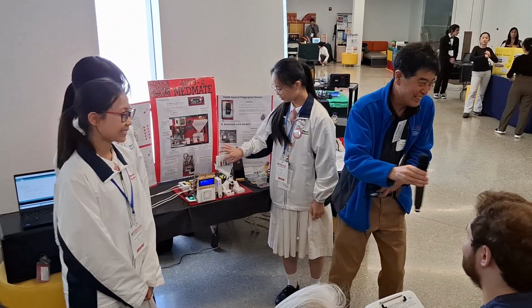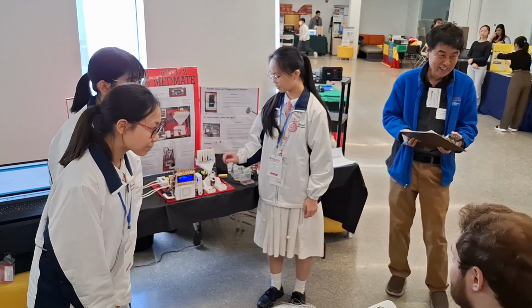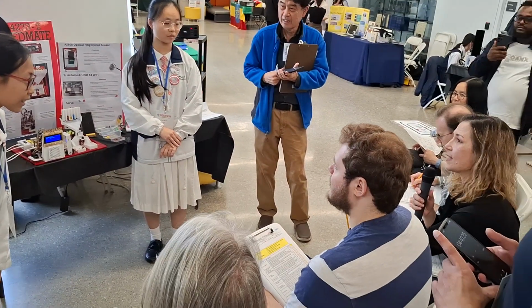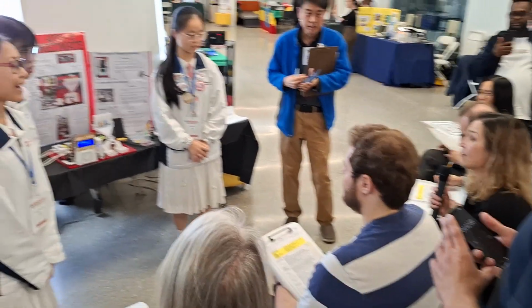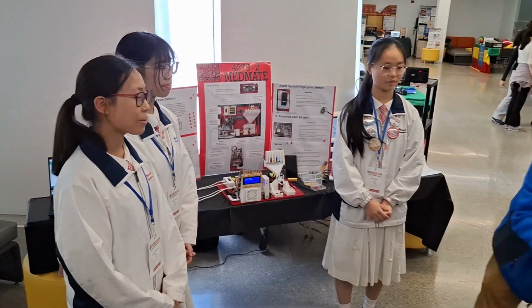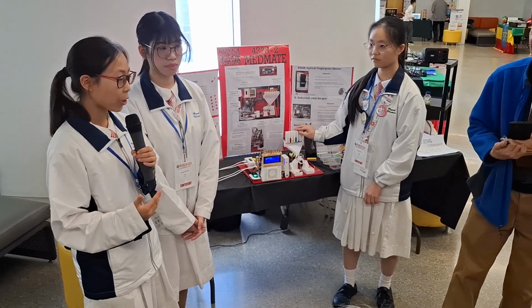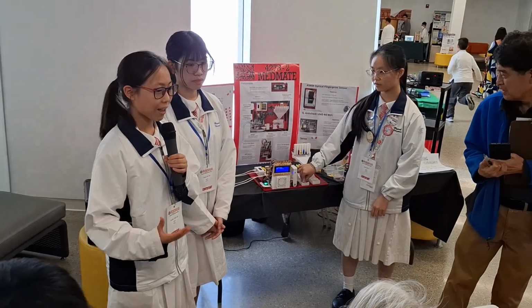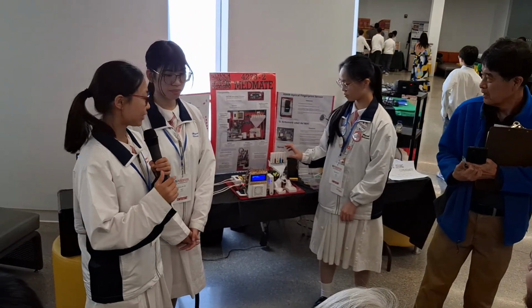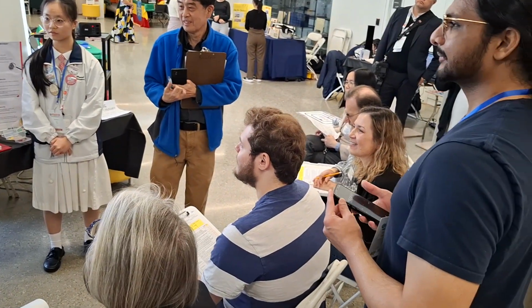Any questions? I have a question. Beautiful project. I was wondering, is the device going to be filled by pharmacists? So who's going to fill the pills in? The patient, or the caregiver. It will be used at the patient's home, so that they can have a more stable time schedule to take the medicine and make sure they are on the treatment track.